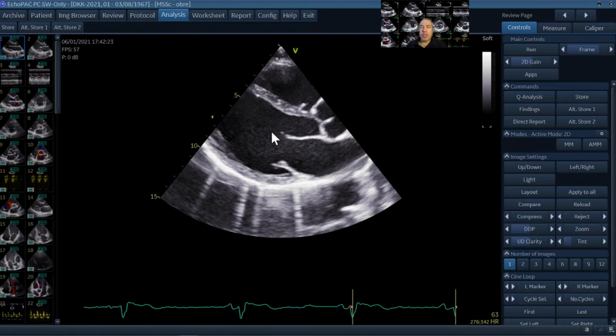I also do this nowadays almost always in a 2D image. You might use the M-mode, but there are some pitfalls for the M-mode, and this is typically that it is quite difficult to have the M-mode line in a real good perpendicular direction.